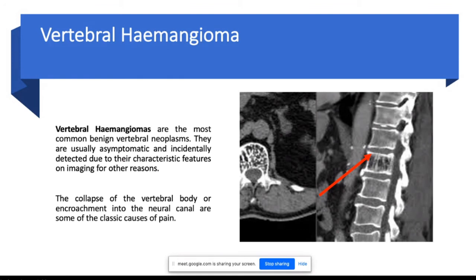So when you take an x-ray, we can see irregular fillings over the vertebral body. It may not look like the other vertebral bodies. It is more like fluid-filled structures, and hence it shows darker spots on its surfaces.